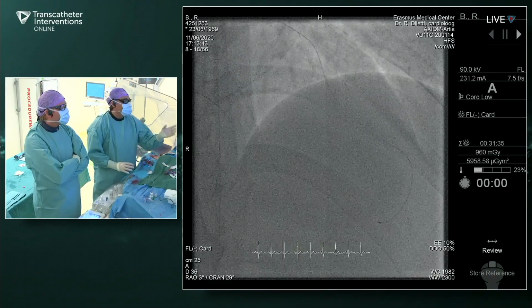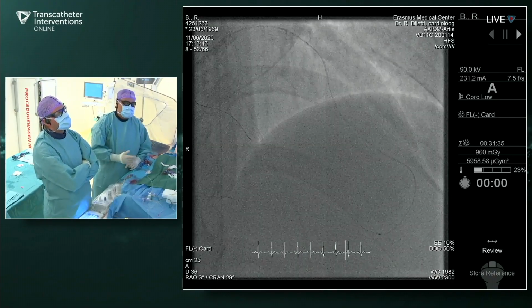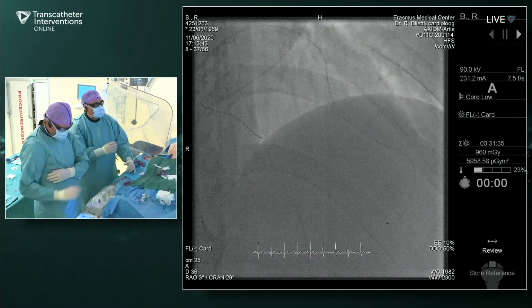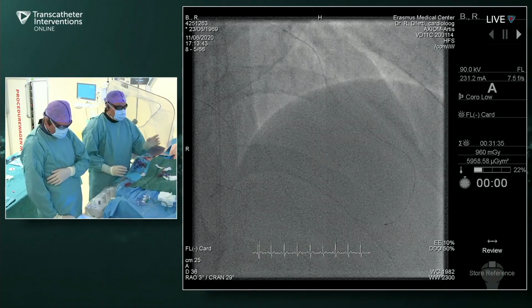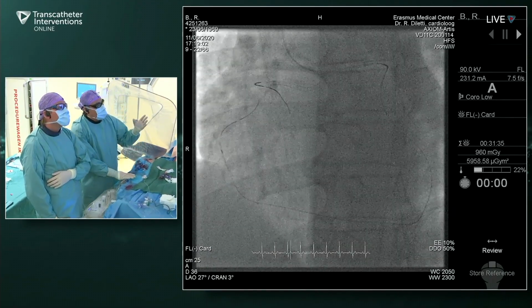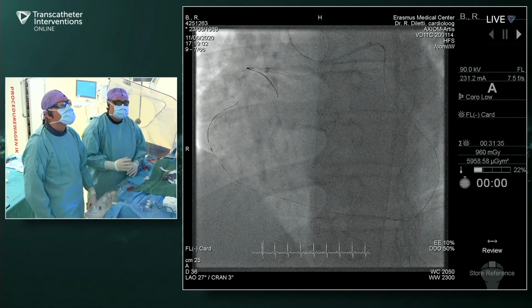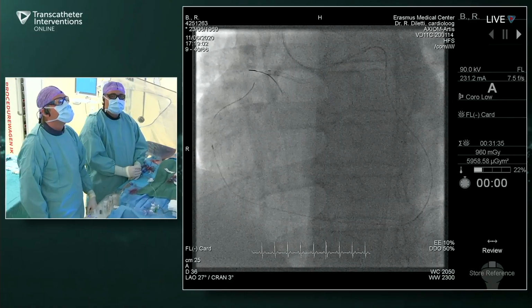We can. So if you look there, I was gently turning this microcatheter clockwise, and then it popped in. So it advanced in the distal part. That was the point with the loop where probably there was spasm. So from this point on, maybe we can see the next. We advanced there, and we tried a retrograde wire escalation technique, but it was really calcified there. I couldn't advance to the proximal catheter.